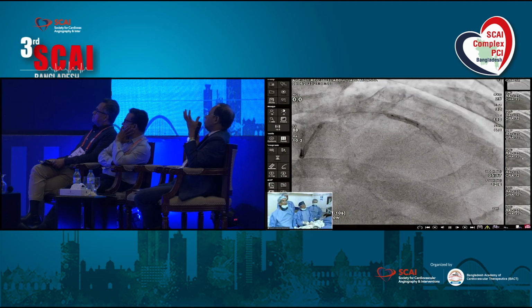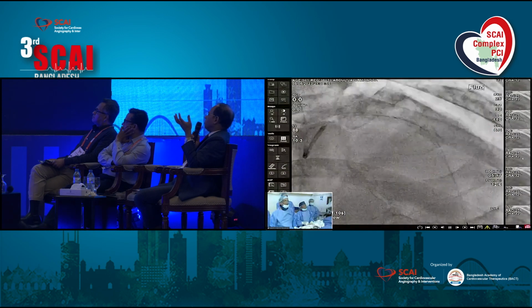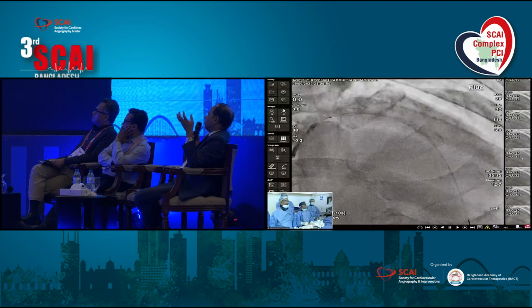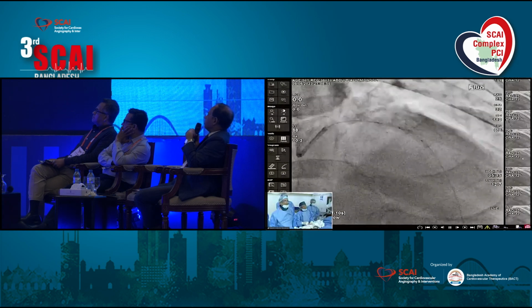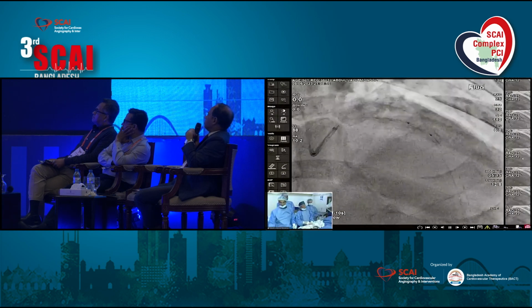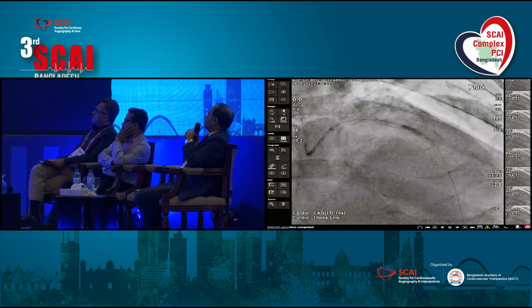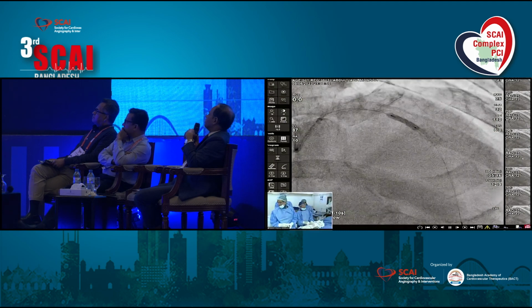So if we go for 10, suppose here 2.7 millimeter balloon, is it adequate to expand the stent well? It is 3.5 balloon. Yes. What is your post-dilating pressure, sir? 12 atmosphere. 14 and now we are going up to 18 and 20.